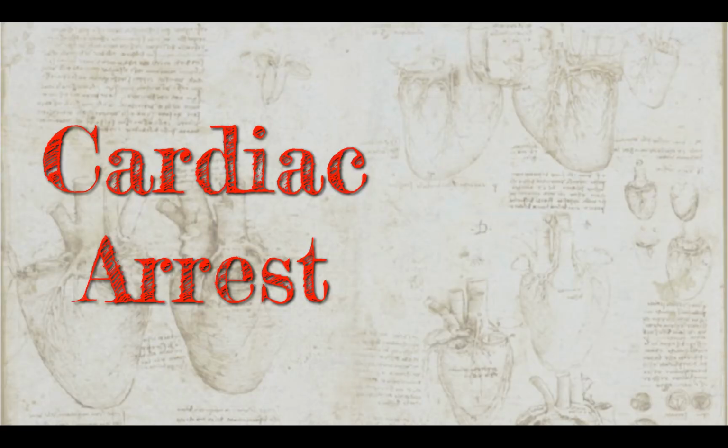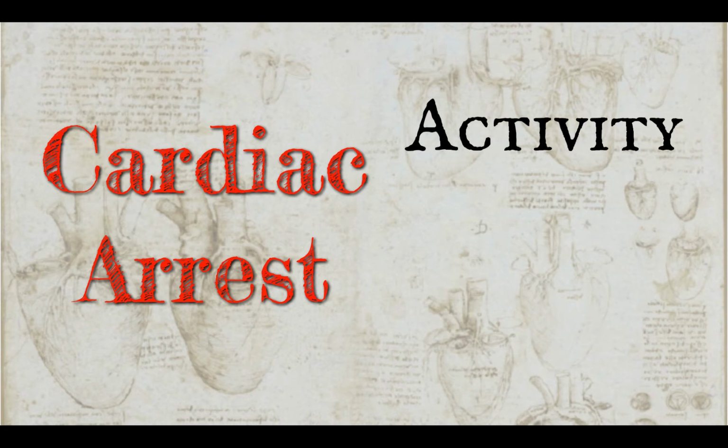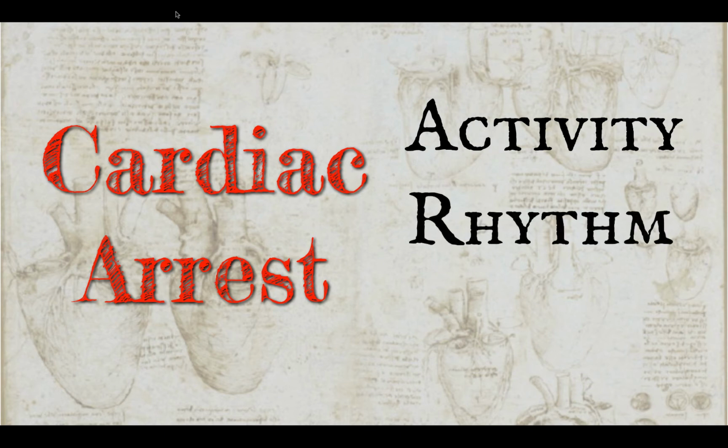So how else can ultrasound help you in cardiac arrest? There are three big ideas I want to get across for the remainder of this talk. First, I want to talk about the importance of defining cardiac activity. Second, I want to talk about the notion that the electrical rhythm that you see on the monitor is not always the same as the mechanical rhythm of the sick heart, and that sometimes that mechanical rhythm is more important in guiding management and predicting prognosis of a sick arrested patient. And finally, we will talk about the importance of situational awareness during a cardiac arrest, and not wasting time while doing ultrasound during a code.